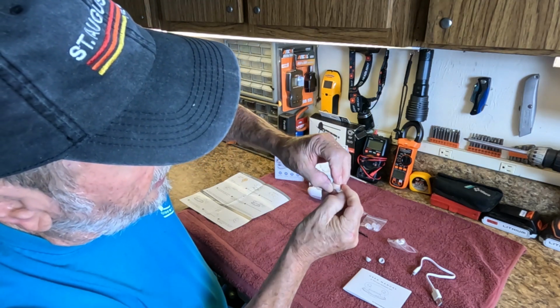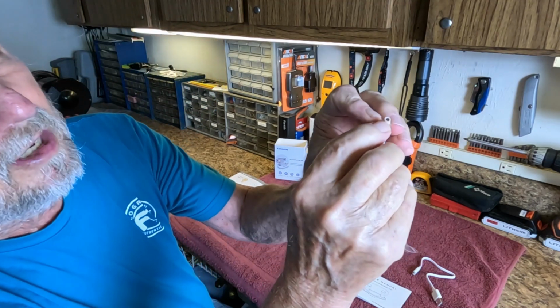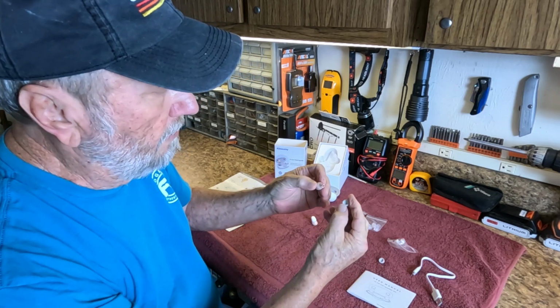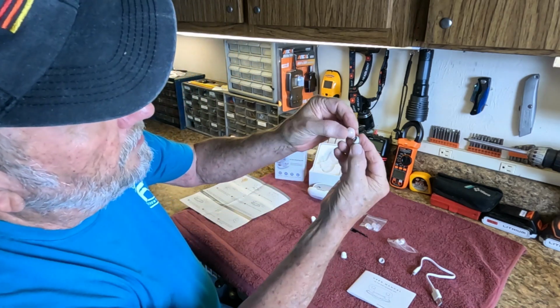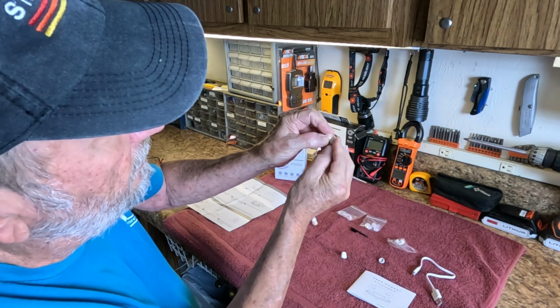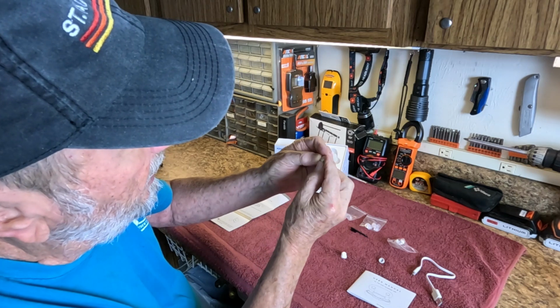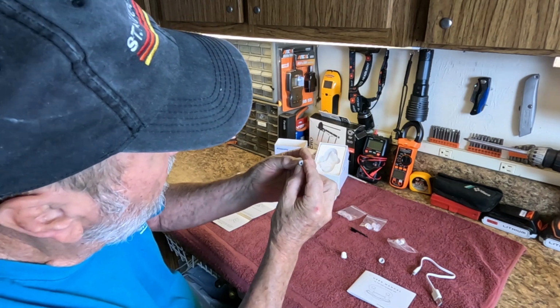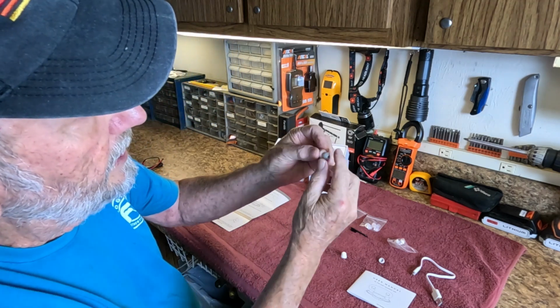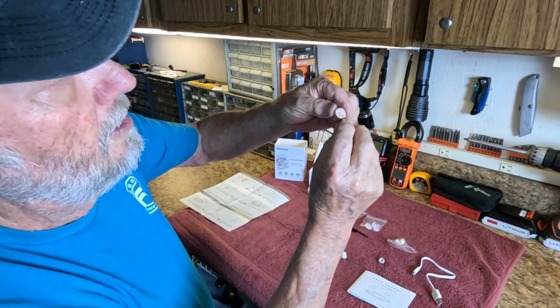And then you just kind of pull it over to the side, and you see you got a little lip right there. And that one's off. This one, just put it into the side like that, and then just push it over, and then wiggle it around, and it should be at the end like that. Okay, there's one. This is the right one.